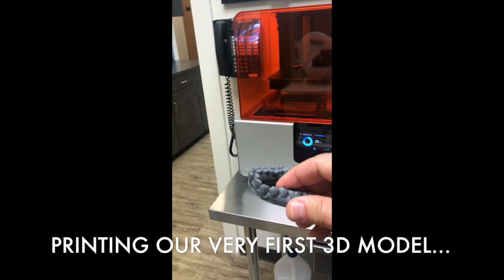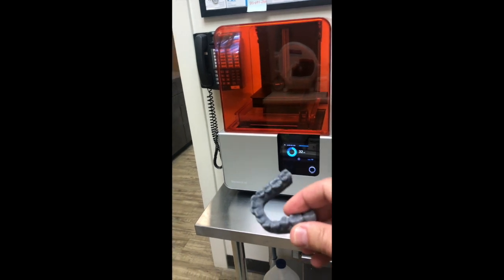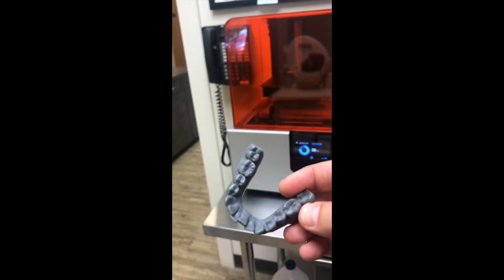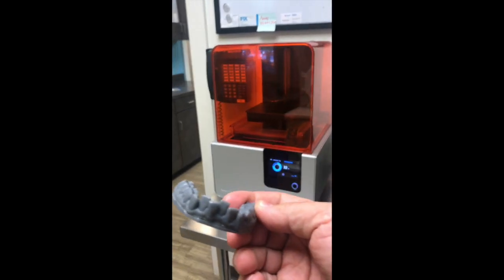Check out my new toy — it's a Form 2 3D printer, and we are going to start making our own aligners. We've already printed out one model, which is gorgeous, with beautiful detail. And we're getting ready to ramp up and start making our own aligners to make it more affordable for patients.